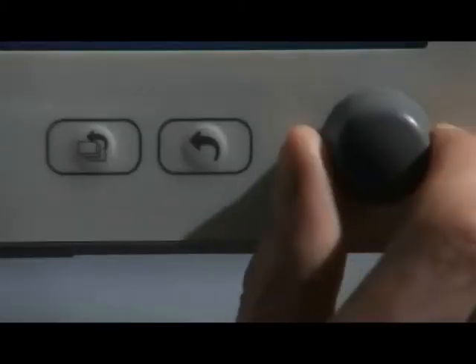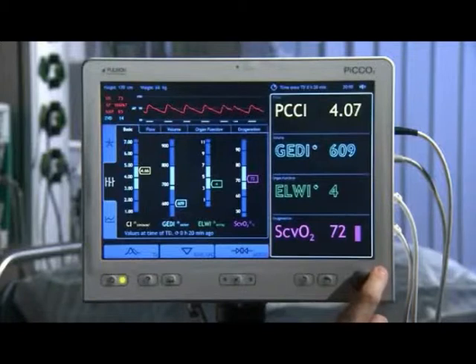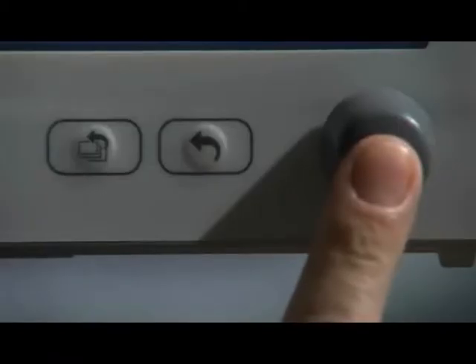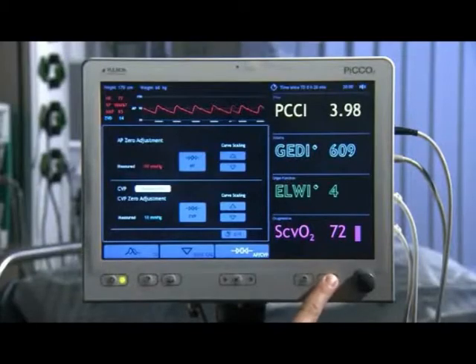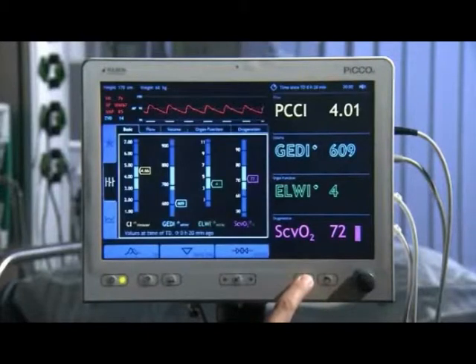Alternatively, you can use the navigation button. The white frame indicates the current position. You confirm all commands by pressing the navigation button. If you want to change the level with the navigation button, press the back key. The main menu brings you to the Start page.